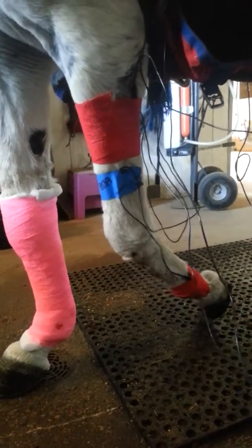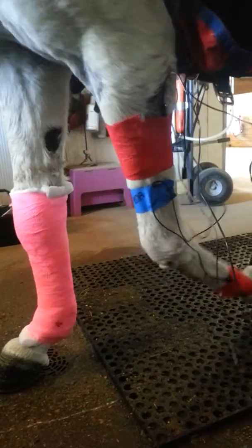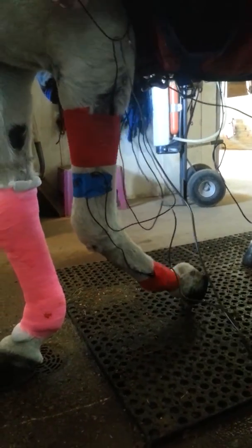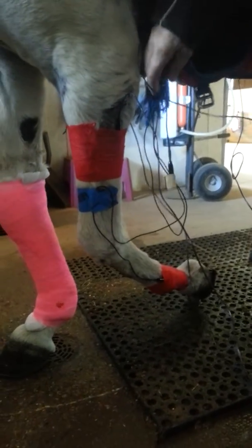I think that plate off of his wither has come off — it's hanging. Yeah, I know that one is, but I'm not using that one anymore. I just wanted to let you know it was down there.